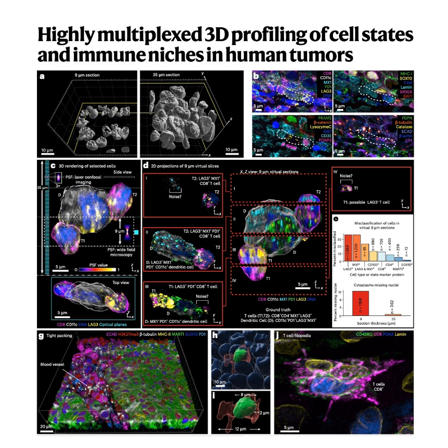They aren't necessarily meant to completely replace standard 2D histology for all diagnostic tasks tomorrow, but they provide the essential ground truth data. They allow us to finally understand and, importantly, correct for the massive 95% fragmentation bias that has unknowingly plagued thin section analysis for decades. It's like getting the answer key to check our previous work. So it's a reference standard, a way to calibrate our understanding.